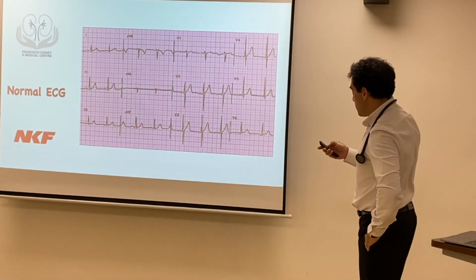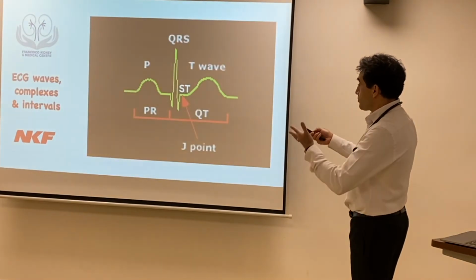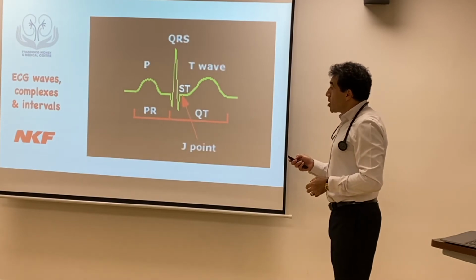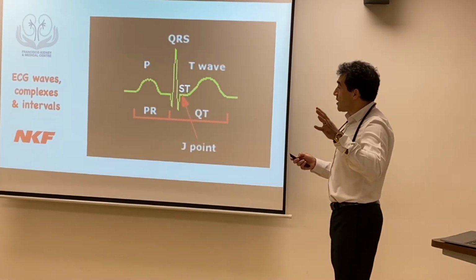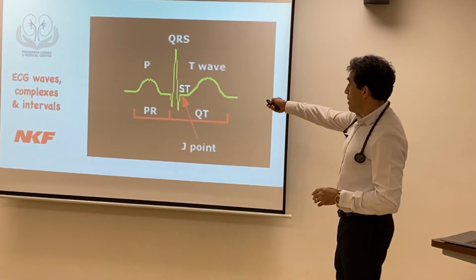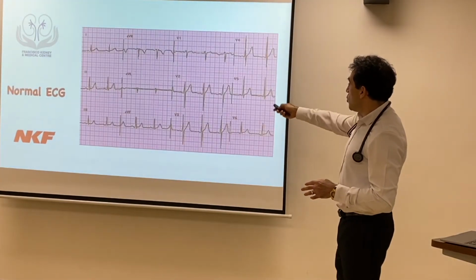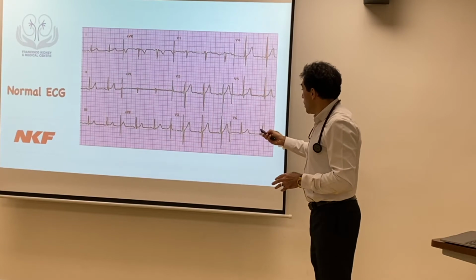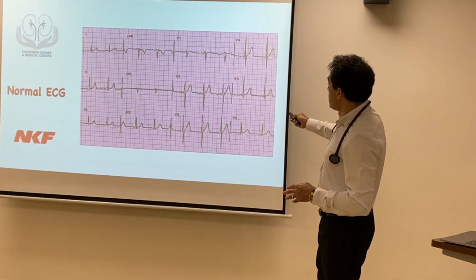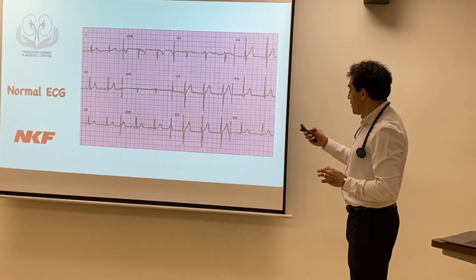Obviously it takes a little bit of time, but it is crucial. And remember all those complexes and curves and waves and intervals, all these PQRS, translate eventually into all these 12-lead ECG. And each one looks a little bit different, because, as I told you, you are watching the heart from different perspectives.